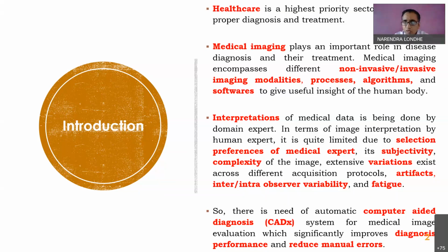Okay, so these things are involved in the different medical imaging, and there are different algorithms and software given by the companies that prepare those equipments, to visualize those images and to measure the abnormal sections or abnormal organs, so that the radiologist can interpret something. Whatever those interpretations are, they require very expert knowledge in that domain, right? Doing an image interpretation is not very easy. Unless you have expertise in interpreting such images, it really gets difficult.